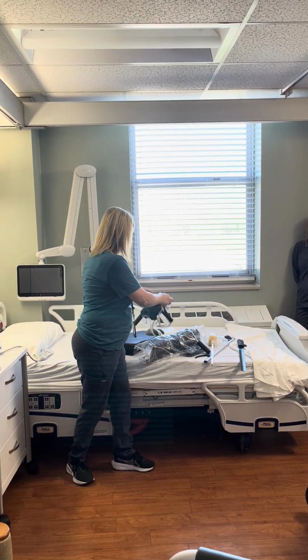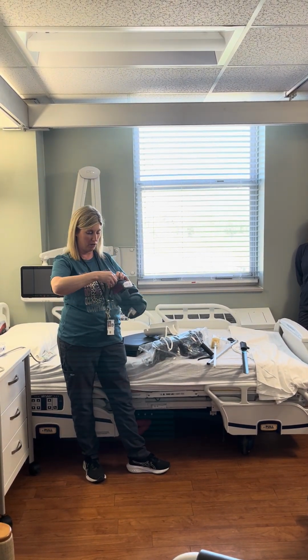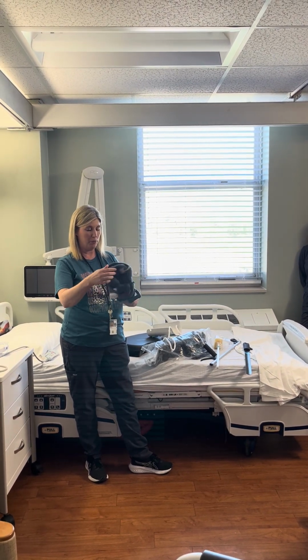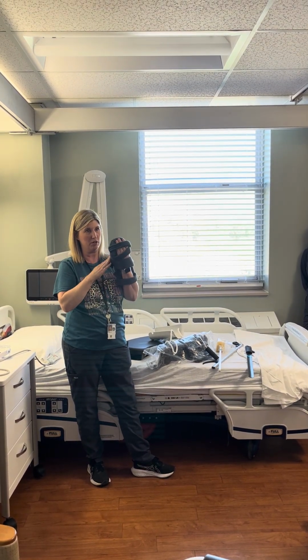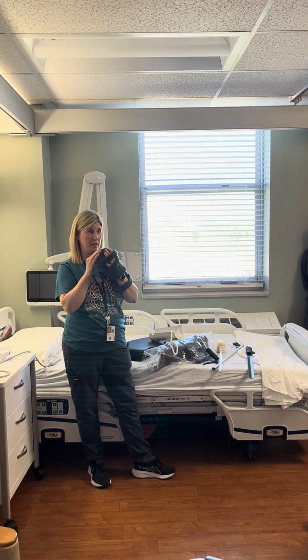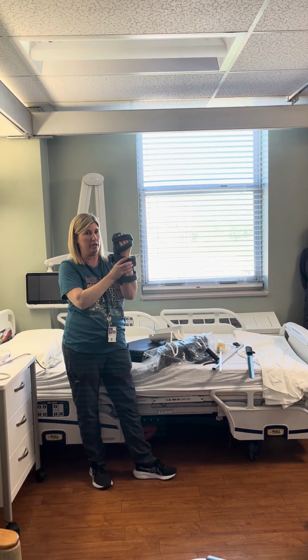You will also see we have these splints. These are the ones that we issue out. They're color coded for all of these straps, so you really can't mess it up. We want to make sure that they wear this at night. We want to make sure that the straps are nice and snug, especially across the fingers, because with a stroke hand, the fingers kind of start melting down. So we want those tight, and this one against the wrist.